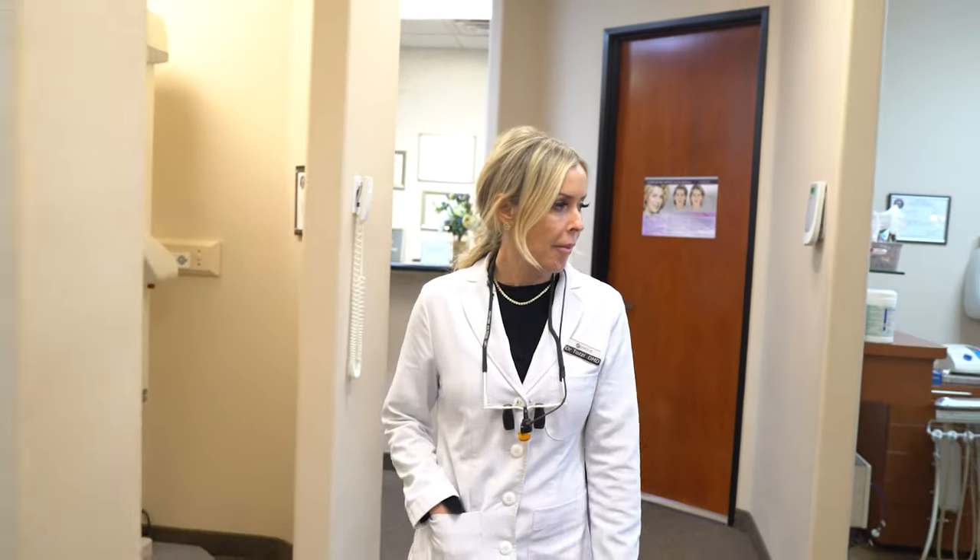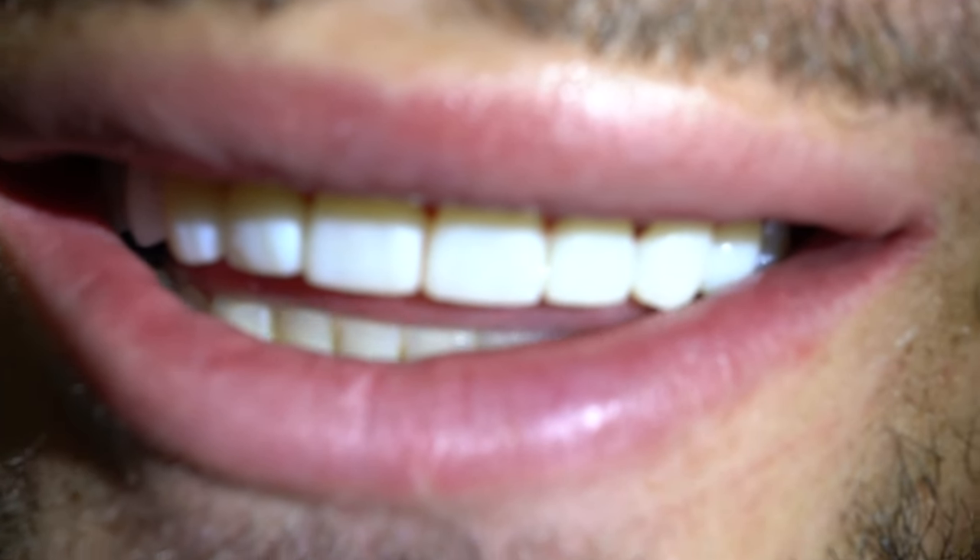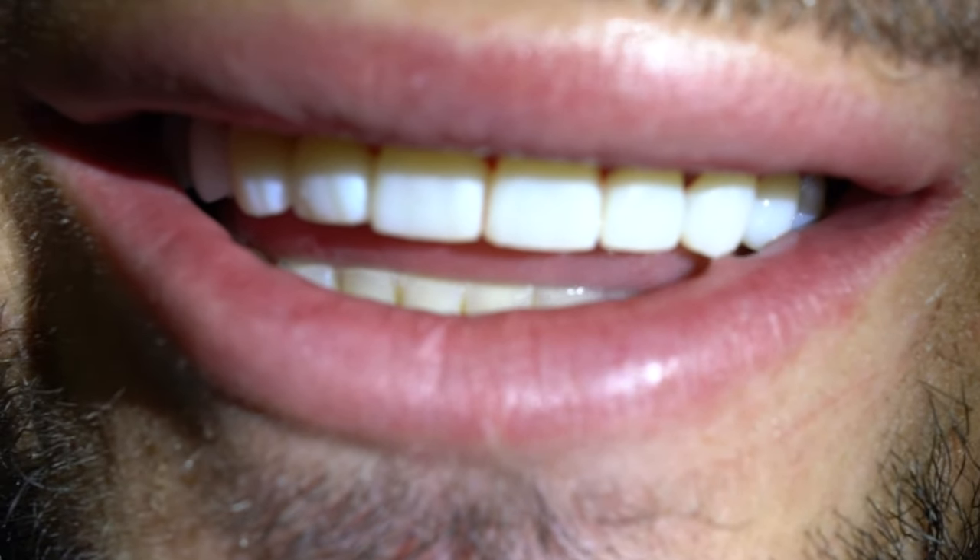So just a quick recap on what we did on DJ Sub 1 today. I brought him in, got him numb, prepped out his 10 top teeth, and went ahead and took an impression of those. Then we put his temporary veneers on — and that's it. The temporary veneers look great. He was absolutely in love with them. We didn't want to completely change how he looked; he just wanted a better, enhanced version of his previous smile, and I think we did it. Mission accomplished.